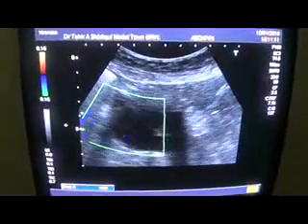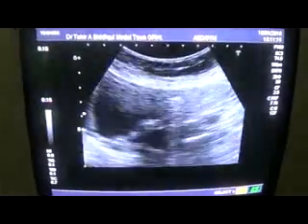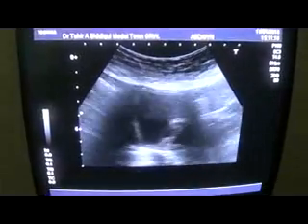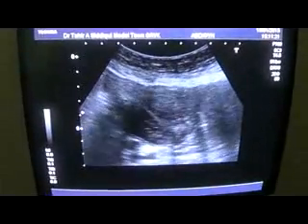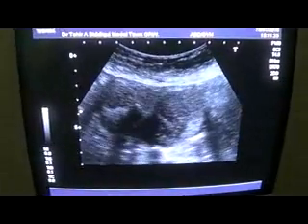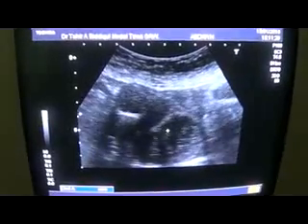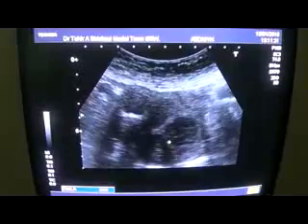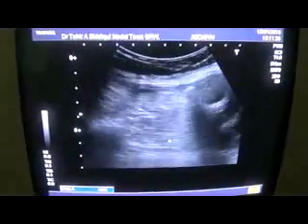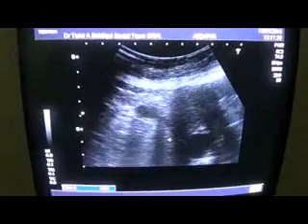Let me get the true dimension of the cystic mass with echoes. Now this medial and posterior region shows echoes. These are echoes within the cyst, a large cyst in the region of the right adnexa, extending up to the right lower abdominal quadrant.